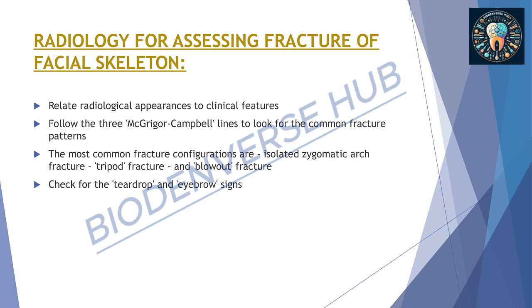Then the most common fracture configurations that are usually found are the isolated zygomatic arch fracture, the tripod fracture and the blowout fractures. You also need to check for the teardrop and eyebrow signs on the radiographic assessment.